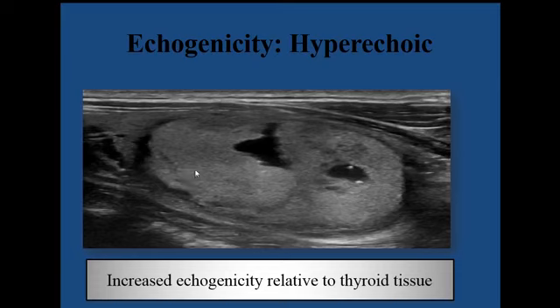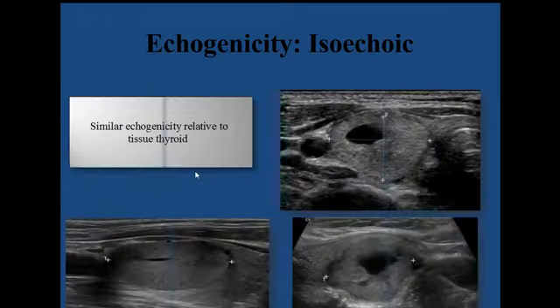And actually, even if you scan a patient with autoimmune disease, like thyroiditis or Graves' disease, and the thyroid is already hypoechoic, you have to compare with the echogenicity that you have. Here I have a nodule. When I compare it to the rest of the parenchyma, it looks isoechoic, and also I will give it 1 point like a hyperechoic nodule.